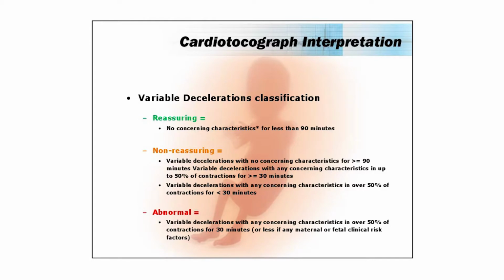I mentioned to you earlier on that you can see it becomes, you can say, oh Lord, how do I remember all of this? I certainly do, and I've been teaching it a long time. So I think we need to have tools. Obstetrics and midwifery is not a memory test on the spot. It's can you interpret the tracing and take a decision on the best care for that mother and baby based on that interpretation. And we should be using the tools to help us do that. And there are some tools available. And I'll come on to those in a second.